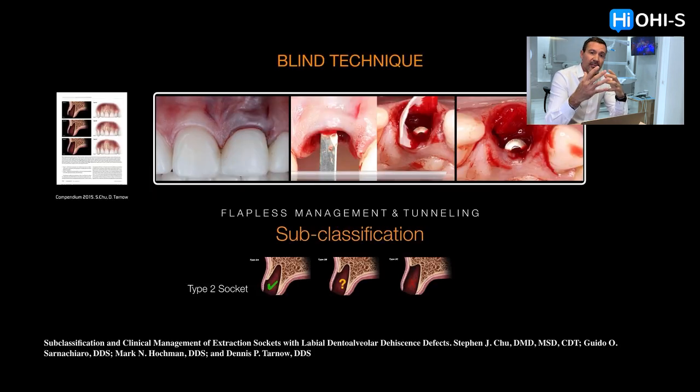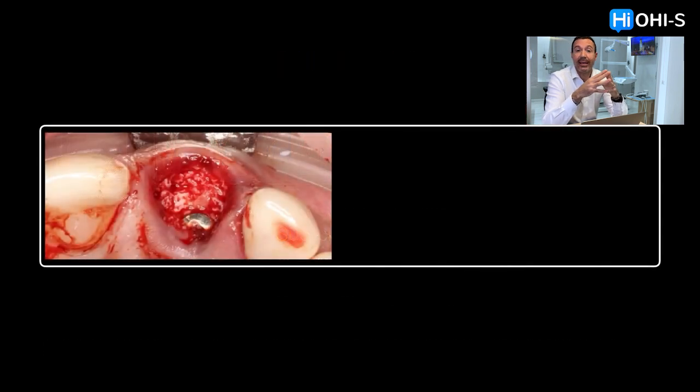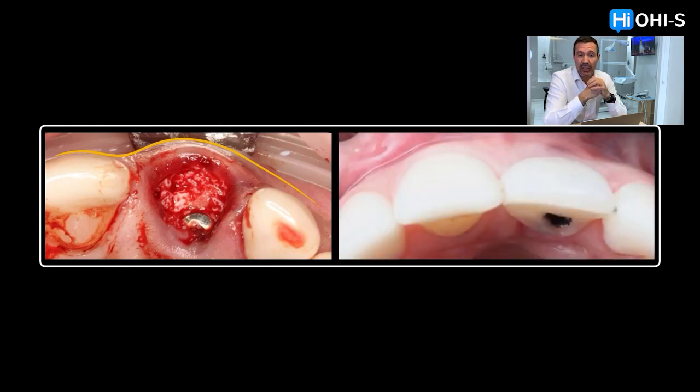We are going to repeat the importance of the fast osseointegration concept and how it can avoid a lot of complications that potentially are going to be there and that we are going to have to face.